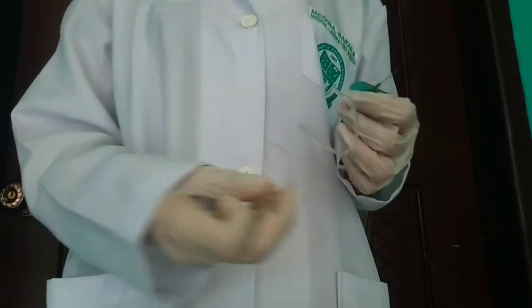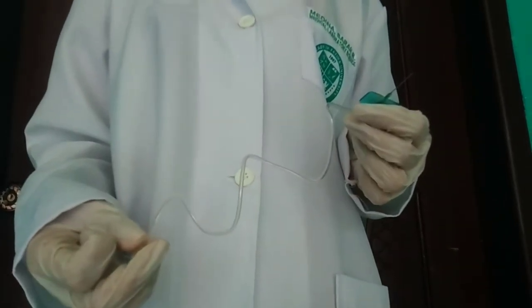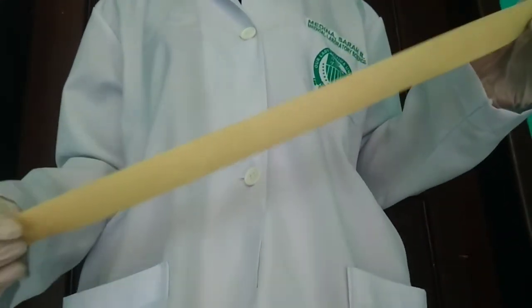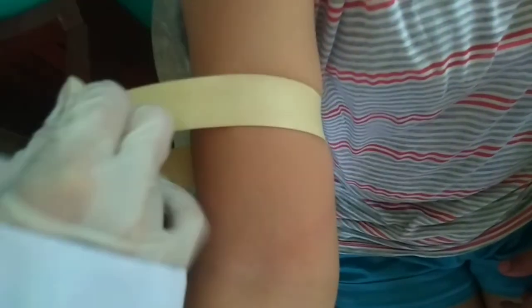The butterfly needle is effective for small or difficult veins, and for elderly and pediatric patients. It allows for more flexibility and precision than a standard needle syringe. The tourniquet is applied to help palpate a suitable vein for drawing blood. When the final tube is being drawn, the tourniquet is released to avoid complications.